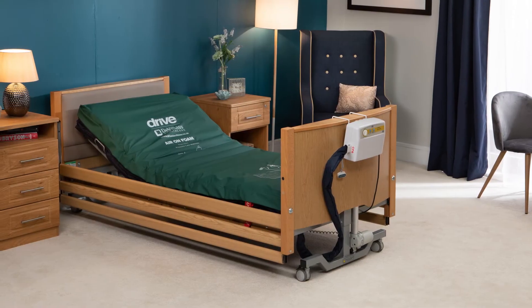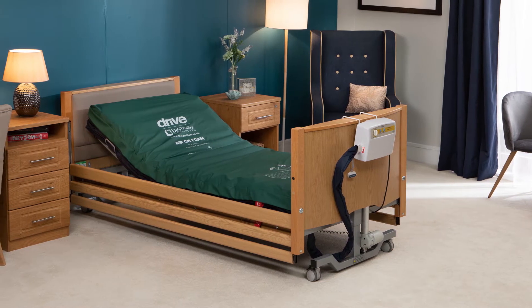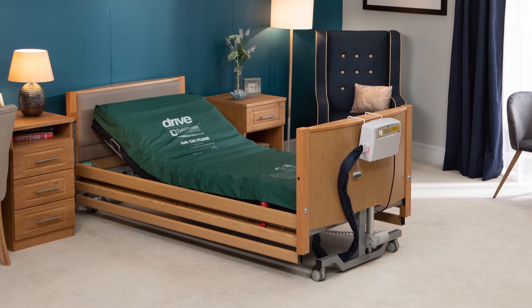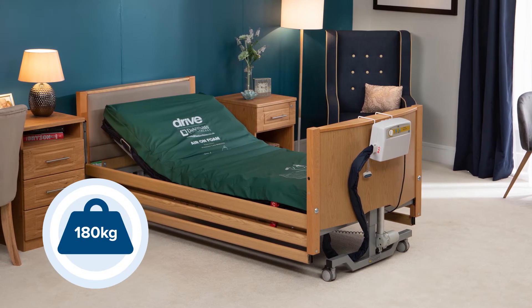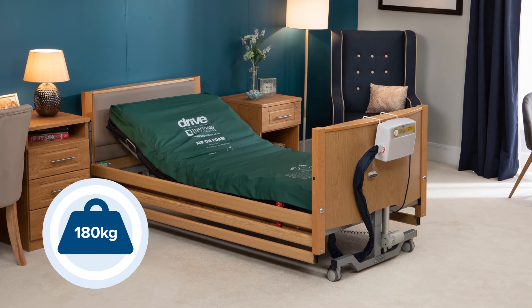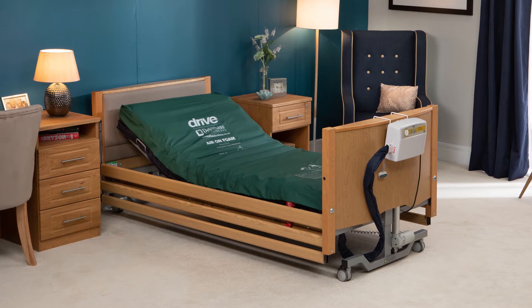The AirOnFoam mattress, which is available with either the Thea or Eros pump units, is a full replacement dynamic therapy mattress. It has a maximum user weight of 180 kilograms, which is 28 stone, and this does include any bedding or accessories that are used on the mattress.